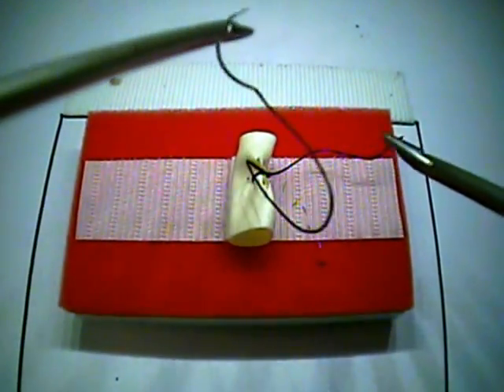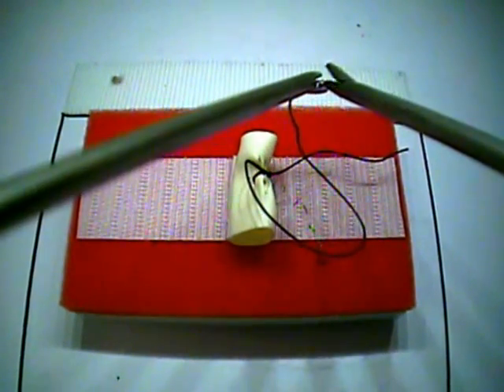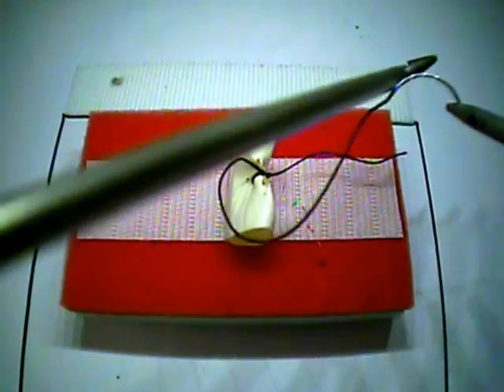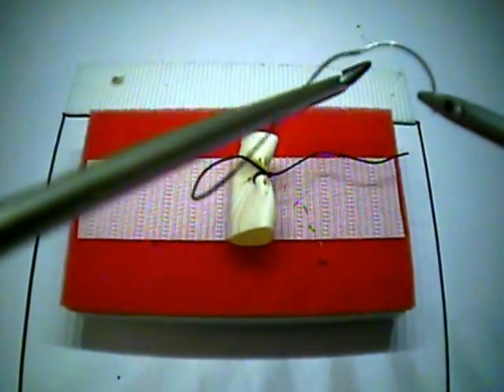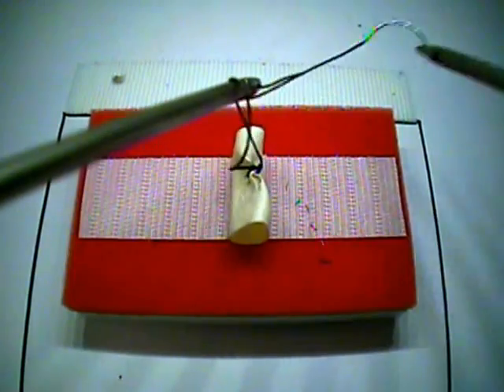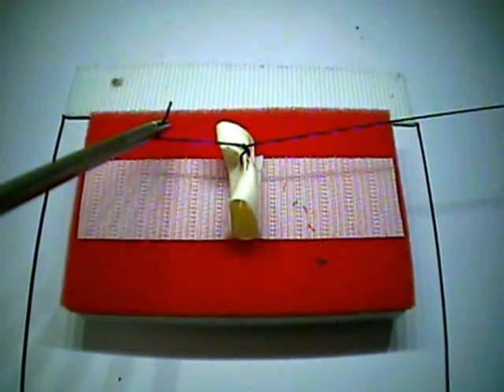And then simply roll the left hand over, grabbing the tip, reestablish the crescent shape of the needle, wrap it once over the opposite hand, grab the free end, and pull apart to complete three throws.